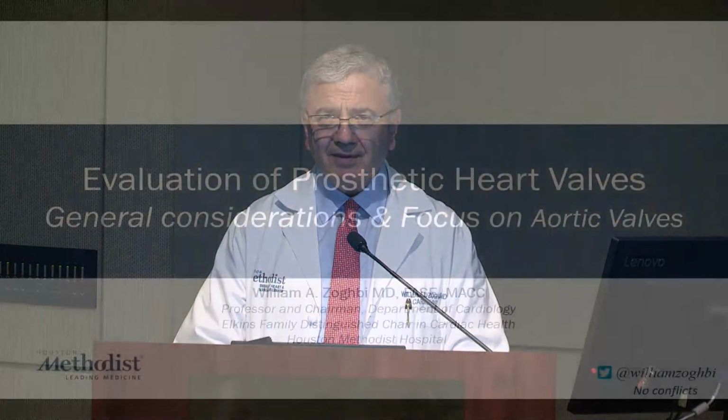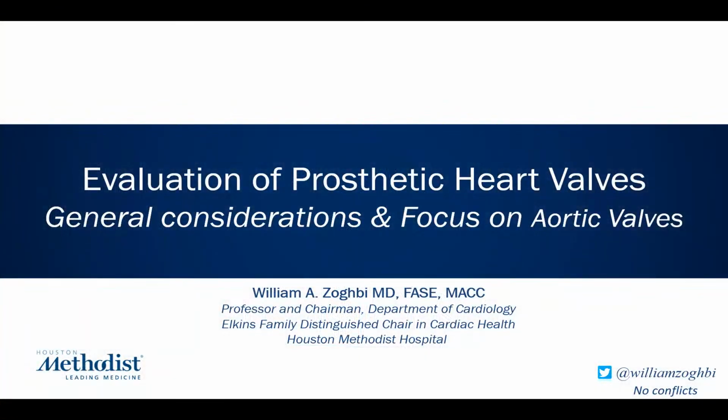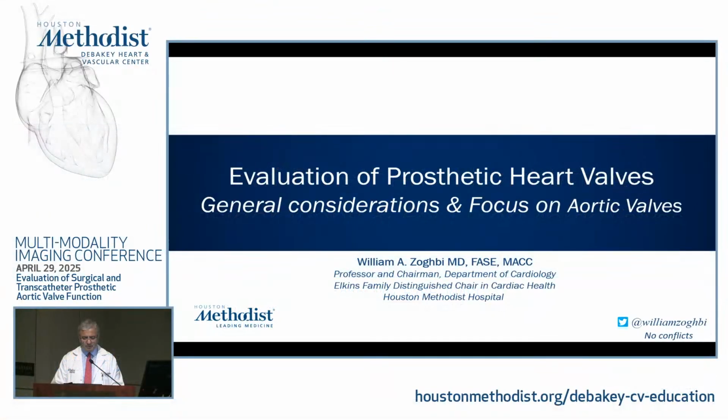Today, I think we will be tackling a topic that is germane, particularly to adult cardiology, which is prosthetic heart valves. Yes, we would like to repair valves most of the time if that is possible. However, a lot of patients may not be able to be repaired, and you have to use a prosthetic valve in those situations.